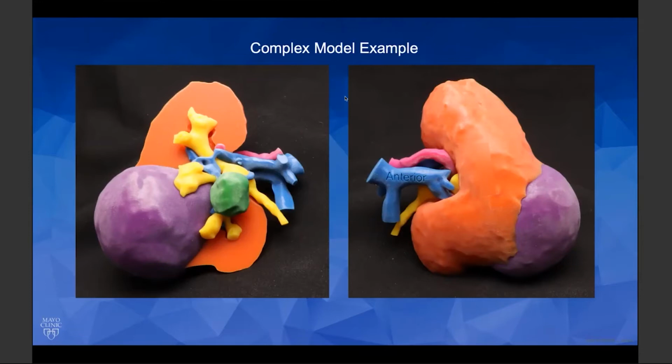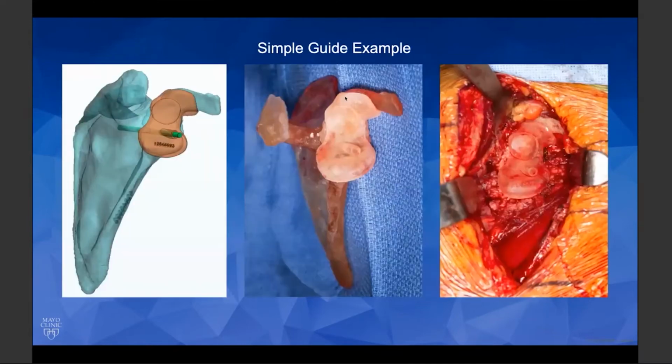So the difference between the first simple model of the spine and this model is that there are more anatomic parts that were segmented to create the model. Here we also use the Stratasys Objet 500 Connex 3 as is dictated by the research protocol, with the palette of Vero Yellow, Vero Cyan, and Vero Magenta, and support 706. The print time was 8 hours and 39 minutes, with 200 grams of Vero Yellow and Vero Magenta, and around 100 grams of Vero Cyan going into this model. We can go to the next case.